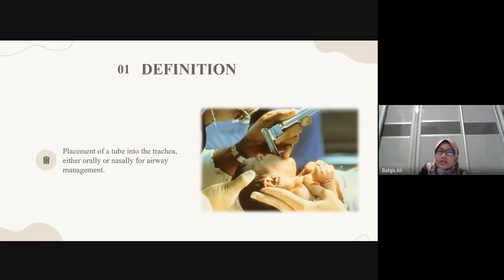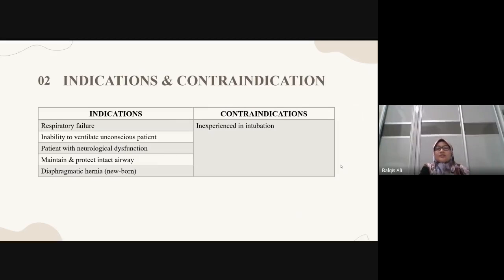For airway management. But today I will present about the oral intubation, where the oral intubation is the preferred method for the emergency situation. If you are not experienced in the intubation, you may need to do the bag and mask ventilation before you wait for the help from the experts. So the indication and contraindication.